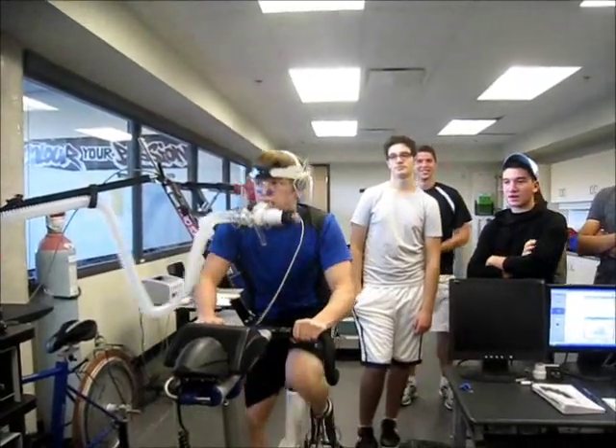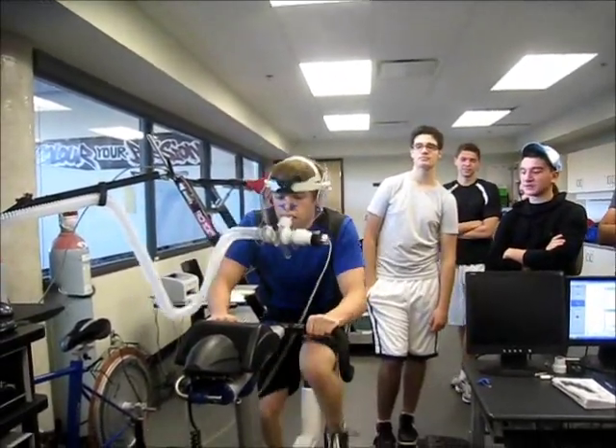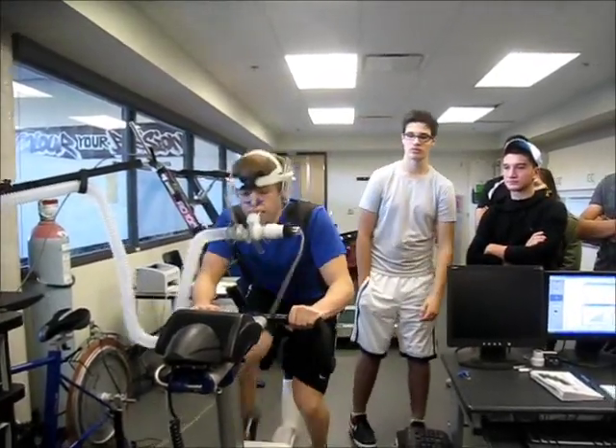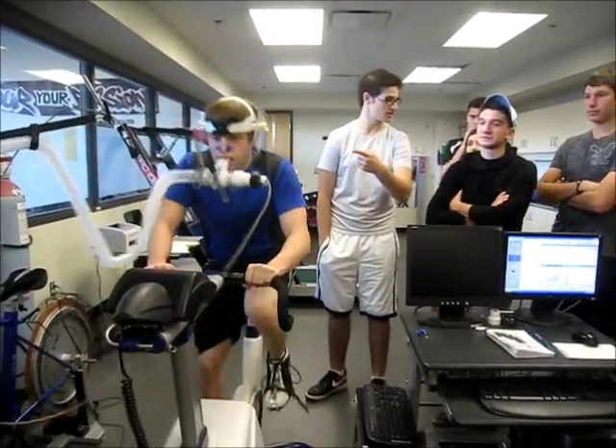And that was for people 20 to 29 — so imagine in four years what a VO2 would be like. Keep going — I want to see 80!